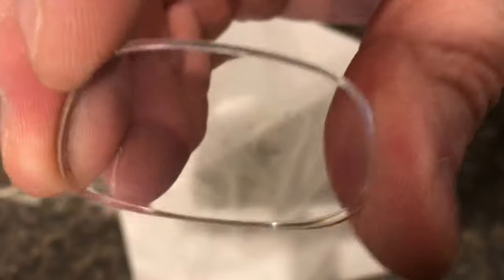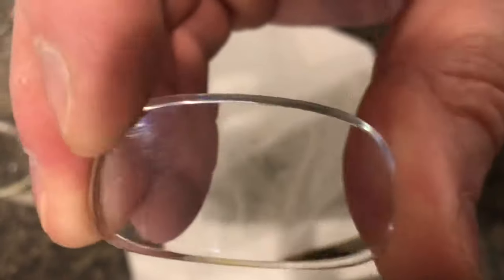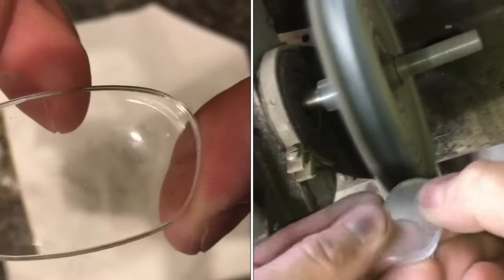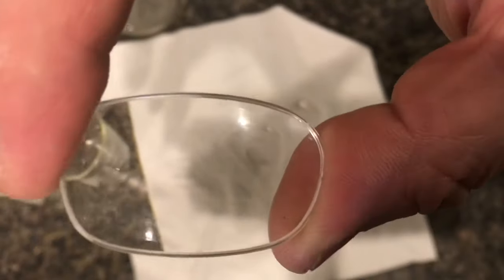If you look closely, you can see that there are some really small scratches in there. Those are possible to get out, but this is nice and clean, and this might be a good place to stop.